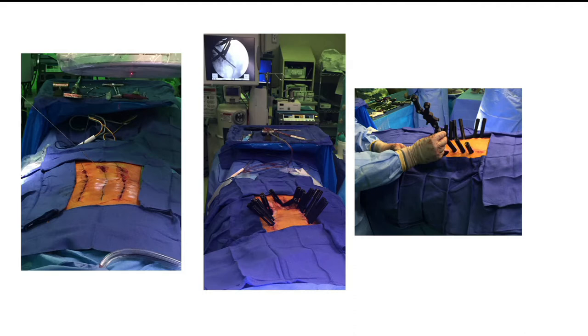You can see how the screws look like an X shape when the towers are out. In this case — T10 to iliac — you see the small stab wounds on the left side. You don't have many landmarks to see where the heads are or how to connect them. The challenge is how to pass a rod and connect it all the way from T10 without seeing anything, which is why you need the entry point very low and as lateral as possible.